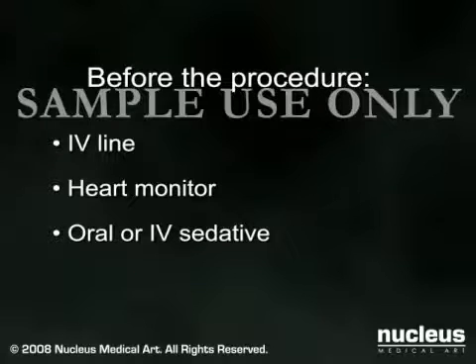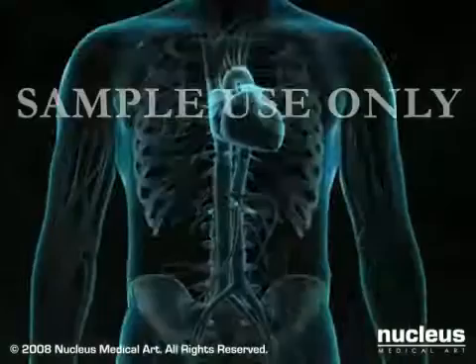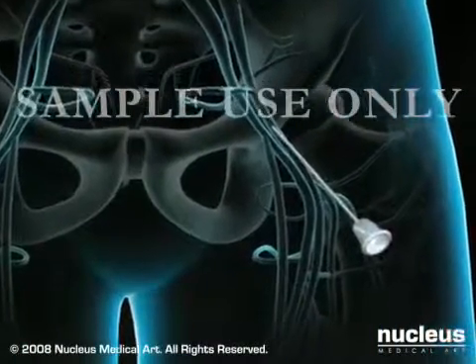Most coronary angioplasty procedures last between 30 minutes and 3 hours. The doctor numbs the skin in your groin area and inserts a needle into your femoral artery.